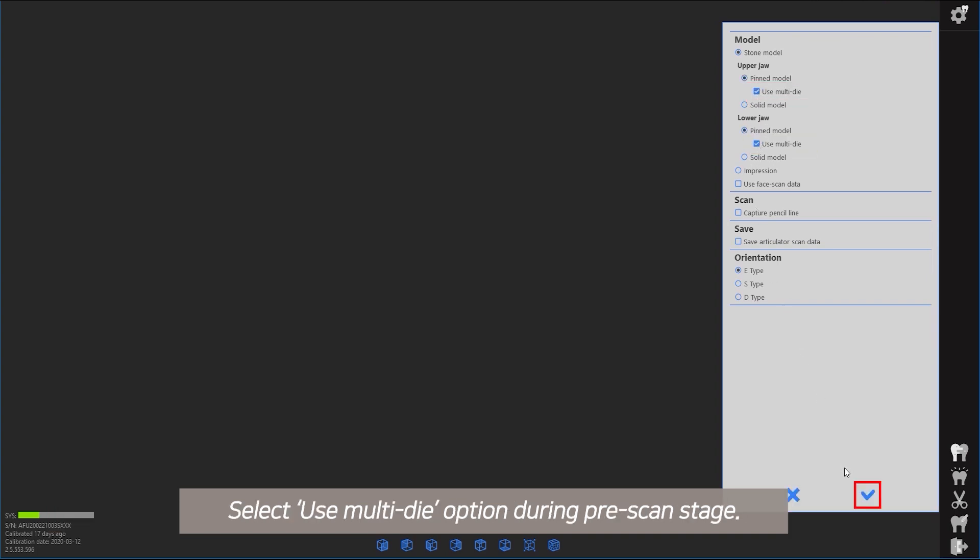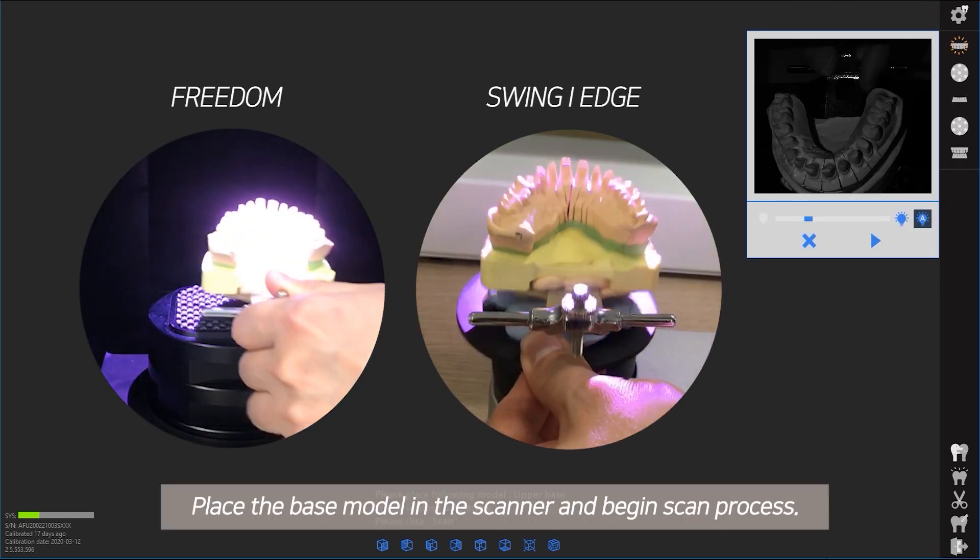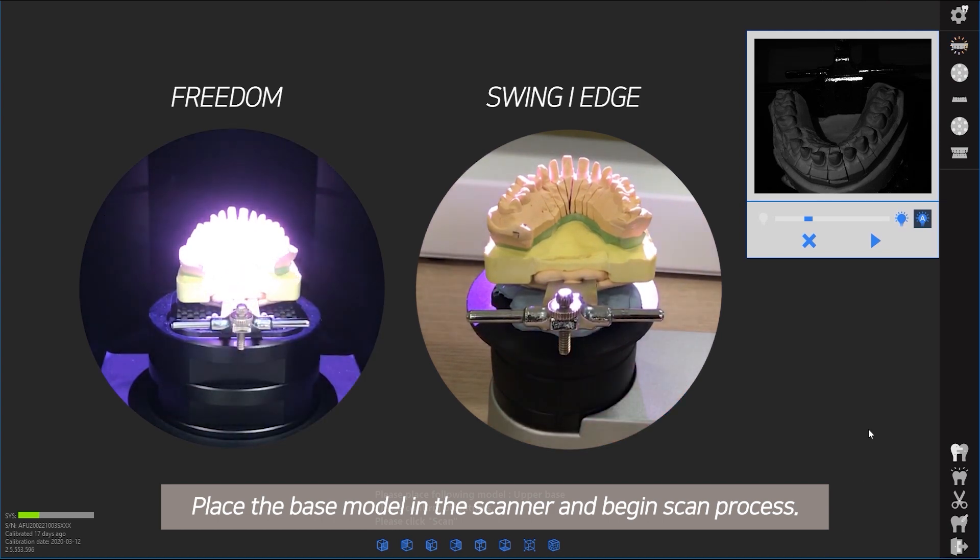Select the option during the pre-scan stage. Place the base model in the scanner and begin the scan process.